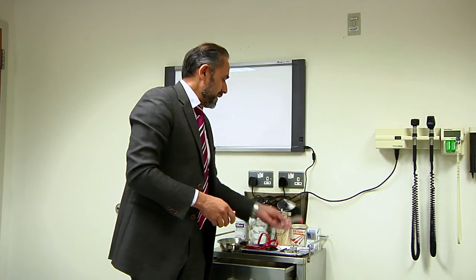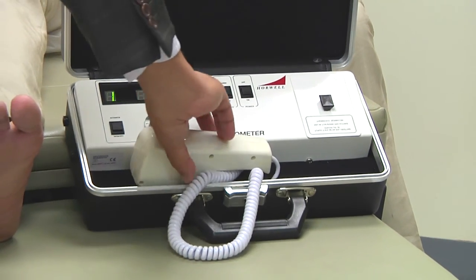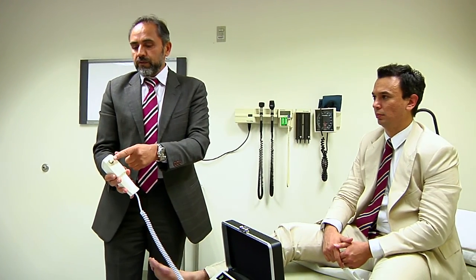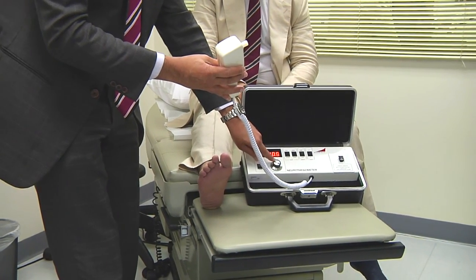So we're going to replace this with an instrument called the Neurothesiometer or Biothesiometer, which allows you to quantify vibration perception, which is a measure of large fiber function, in a quantifiable manner from 0 to 50. 0 to 15 being normal, 15 to 25 mild to moderate, 25 to 35 moderate, and more than 35 volts being severe neuropathy. So this is the instrument, the Neurothesiometer. You essentially have the probe, which vibrates at a given frequency, and this, you can see as I turn it up, goes from 0 to 50.